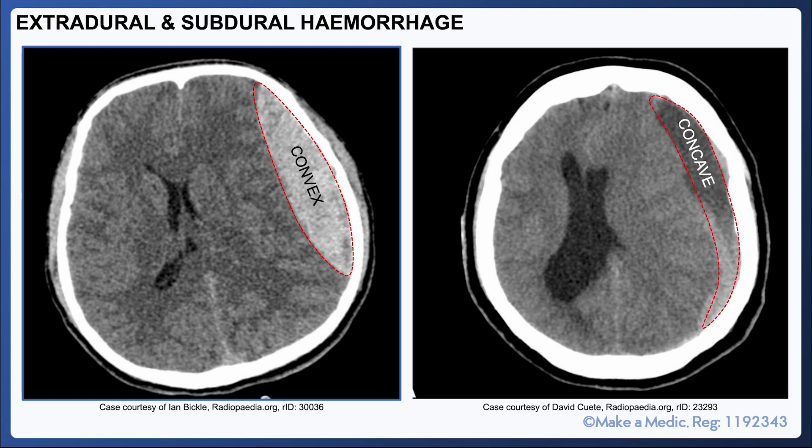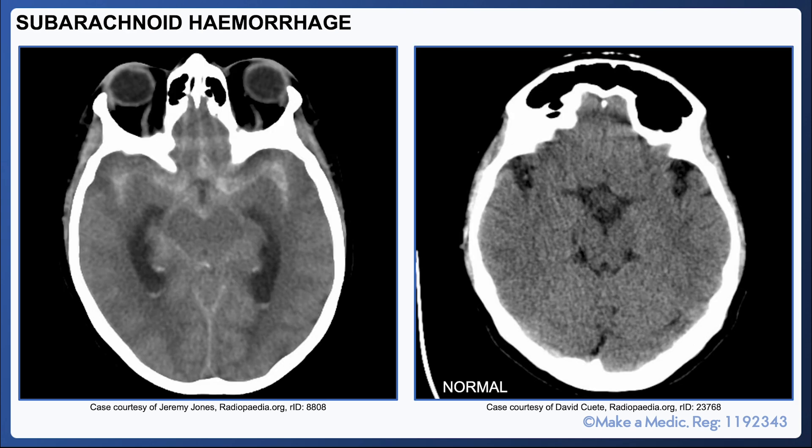Subdural hemorrhages, on the other hand, have a concave appearance. They are venous bleeds that tend to present more insidiously, so the blood may appear hypodense. In the example shown on screen, this may be an acute-on-chronic subdural hemorrhage, as the blood at the bottom is more hyperdense and hence looks fresher than the rest of the blood.